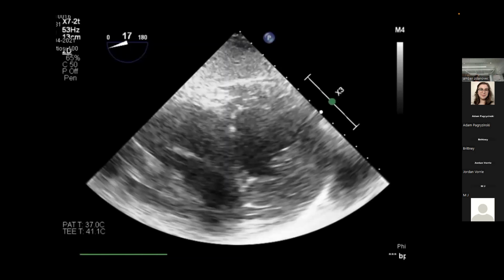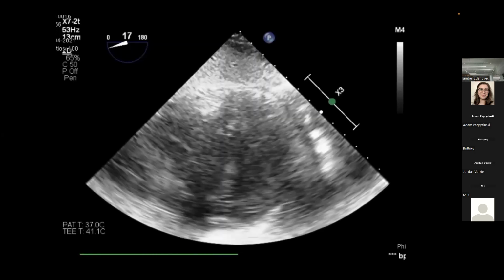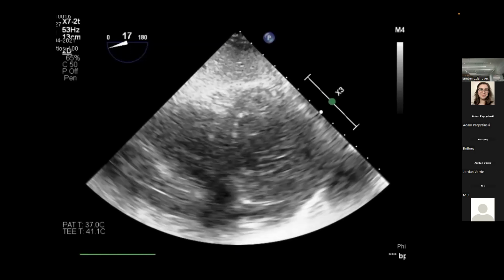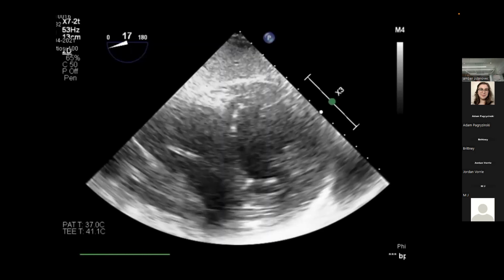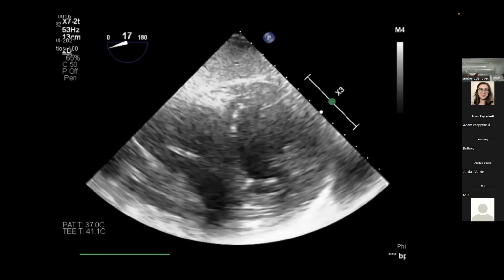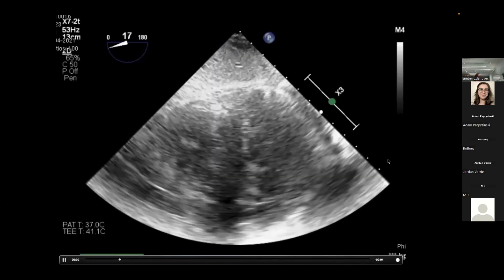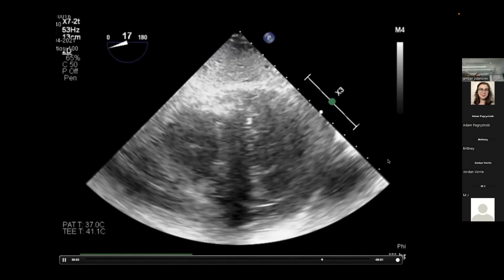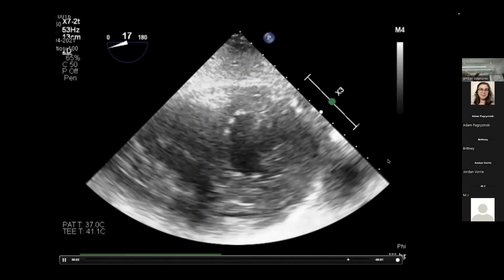And then lastly, and all these pictures are real. You can't always pick perfect patients with perfect pictures. All right, what view is this? Transgastric short axis. Yeah, your transgastric mid-papillary view. This one can be useful when you're looking for a D-shaped septum, either in diastole or systole. Thoughts? Any concerns? No. All right, so what device are you guys going to recommend? Okay, Crescent. So the one that does not provide RV support.